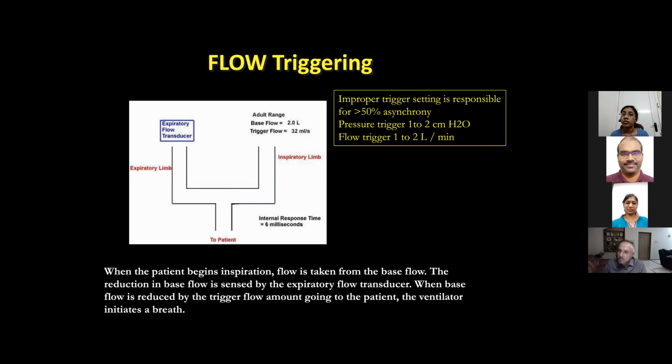You should never do that. In respiratory therapy, paralysis is the last thing you should do. When there is no option, when you troubleshoot and you see that you have exhausted all your capabilities, then only you should go for paralysis. Because most of the time, if you don't set the trigger properly, you go into asynchrony and patient-ventilator fighting. Understood? Okay.